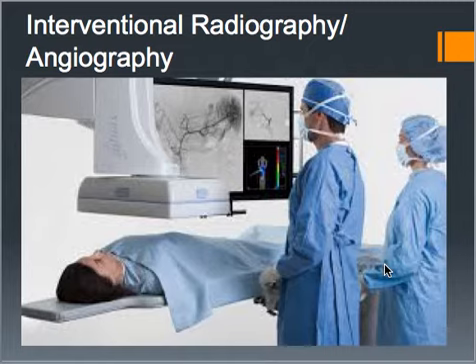So, it's similar to if you think about like in fluoroscopy. Fluoroscopy is the modality, and the upper GI is one of the procedures. So interventional radiography is the specialty, and angiography is that process of taking the images of the blood vessels. But again, they're used interchangeably throughout the text, throughout this lesson, and a lot of times interventional radiography is also just referred to as IR. So we just kind of use the initials instead because it's a little bit easier.